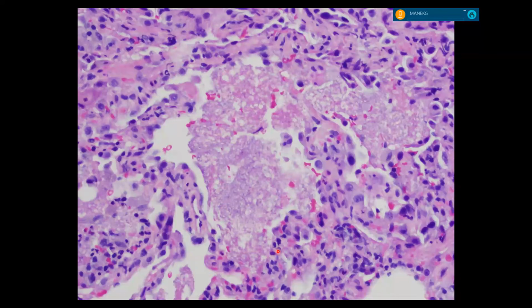Here, just point to it and I'll tell you what. Like this or this? Oh, those are red blood cells. This is a red blood cell. That's a red blood cell. See, the pink of a red blood cell is different than the pink of the Pneumocystis. See, it's a different color. Yeah, good that you pointed, because I can't even think like you do, I can't even imagine.